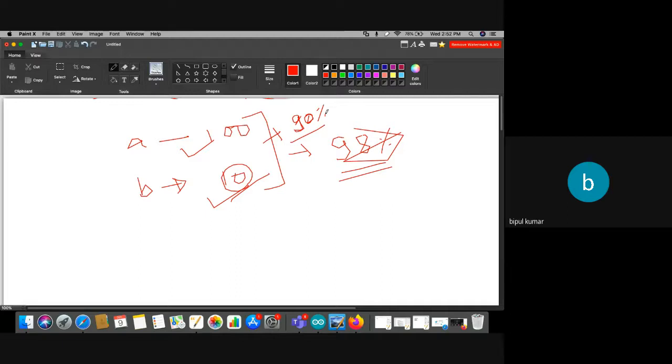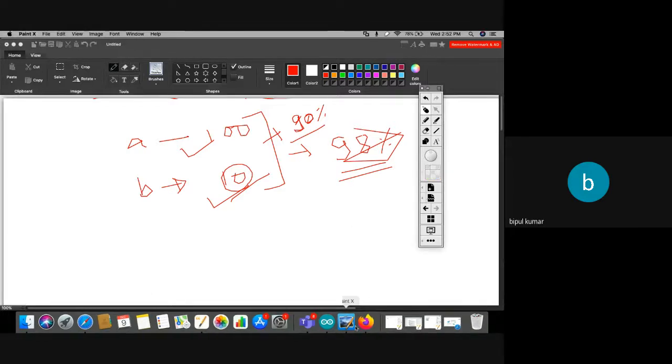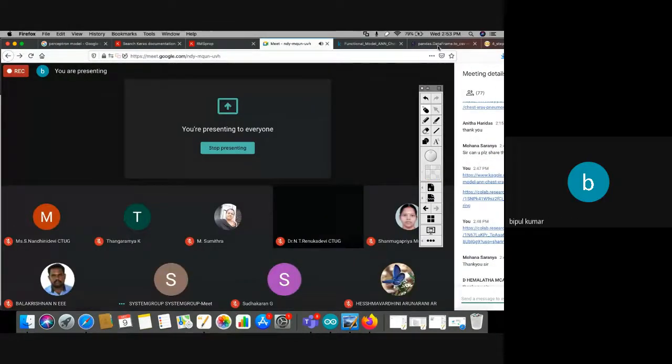Accuracy alone does not help us in evaluating the model. That's why I'm saying, while you go for further things in error evaluation, there is a concept called the confusion matrix. Do read about how the confusion matrix works to evaluate the process. And try with some more different data sets. There are so many things that you are going to learn. So apply the things that you learned today to further scenarios. That's it from my side. Unbalanced data sets will help you.